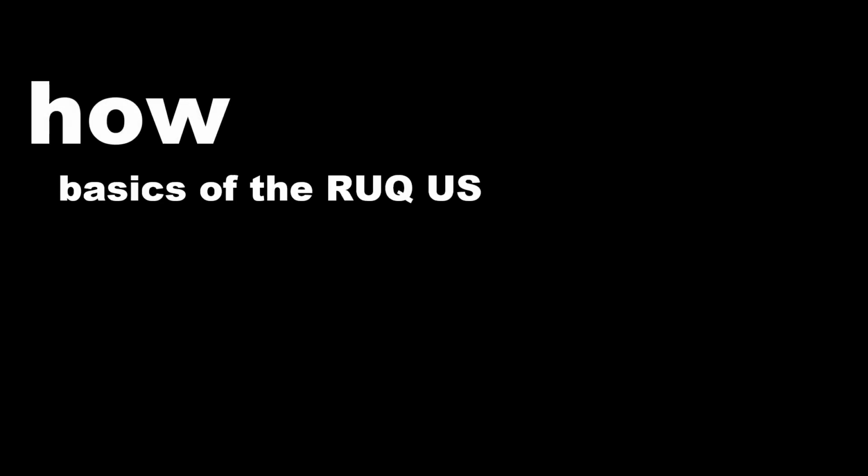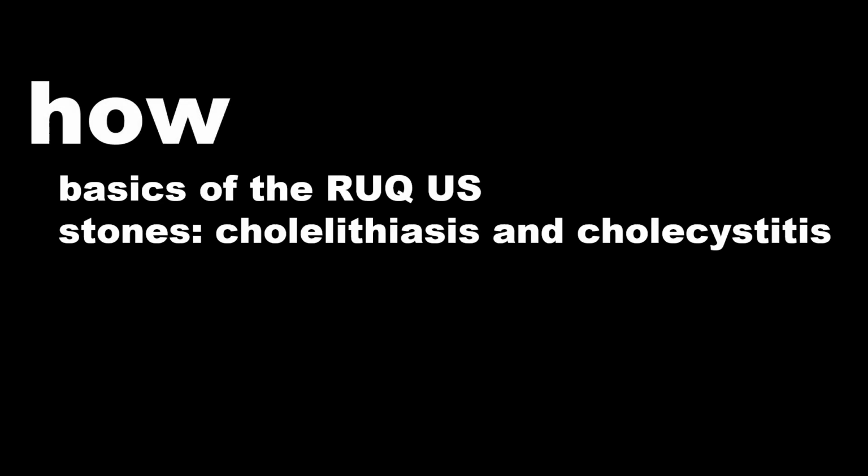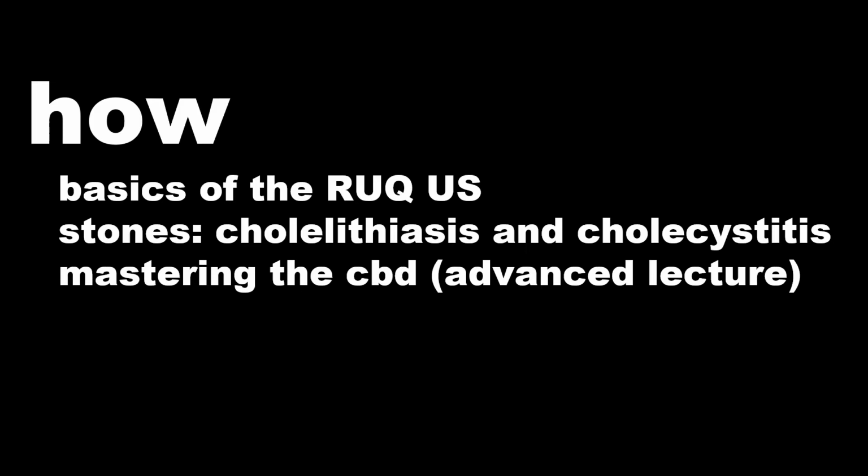In this lecture, we'll cover the how. We'll start with the basics of the right upper quadrant ultrasound. Then we'll move on to evaluating for stones, for cholelithiasis and cholecystitis. And then in the more advanced lecture later today, we'll talk about mastering the CBD.